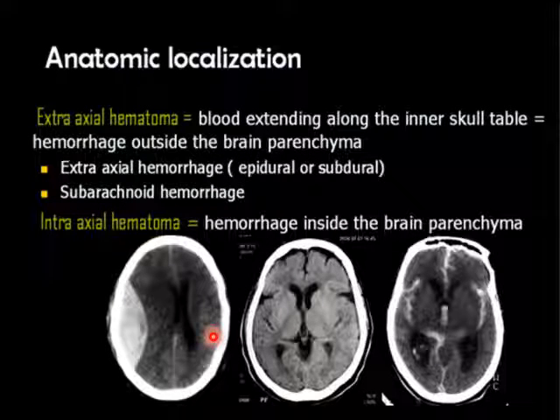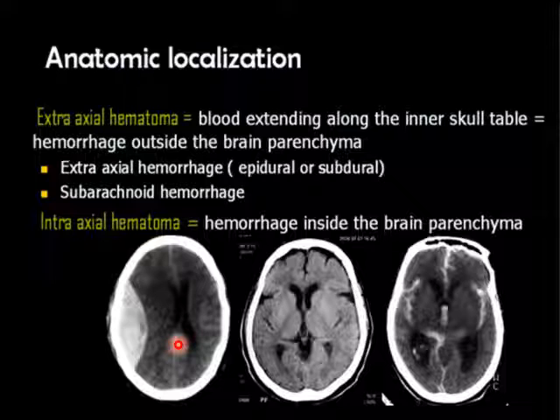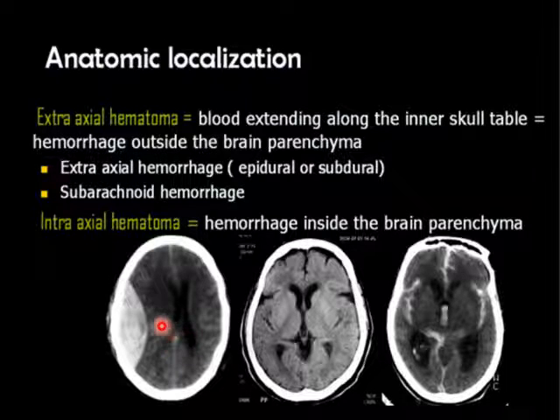So at first we identified this lesion as a hemorrhage because it is brighter than brain tissue, a hyperdense lesion. We saw a hyperdense lesion here. We saw hyperdense shadows here inside the subarachnoid spaces. This is the normal CT.